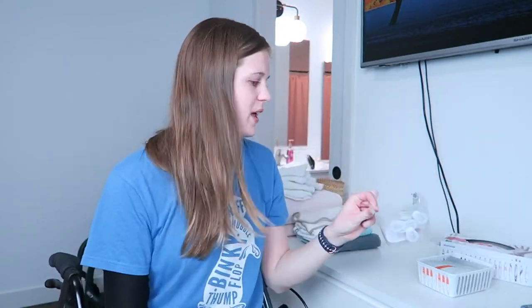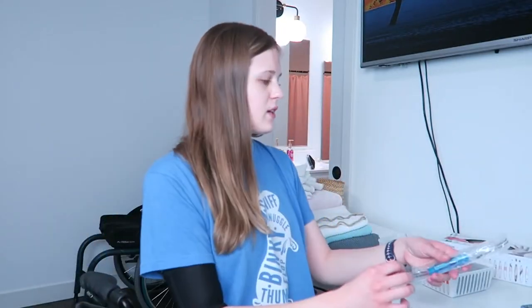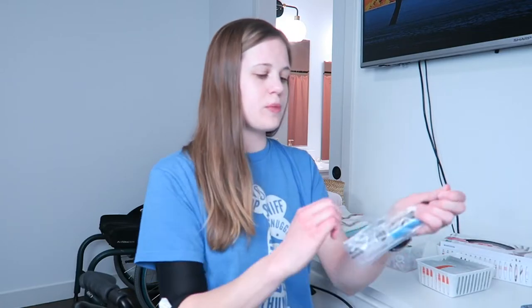All right, done with my infusion. What time is it? 7:50. I think I started at like... about four hours. So, all right, take my sweatshirt off. So first step to being done with all this, I'm gonna grab all the supplies I need. Step one, I'm gonna actually open this real fast, but then I'm gonna go ahead and put on my hand sanitizer. Cause you know, I need to go fast, my camera's dying.